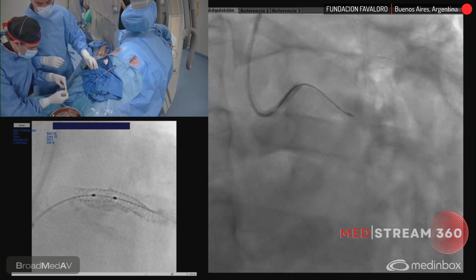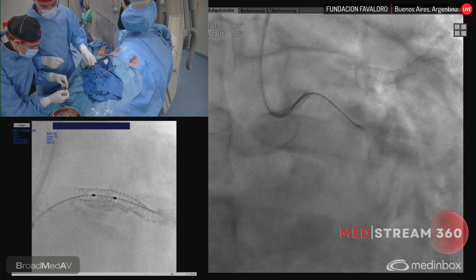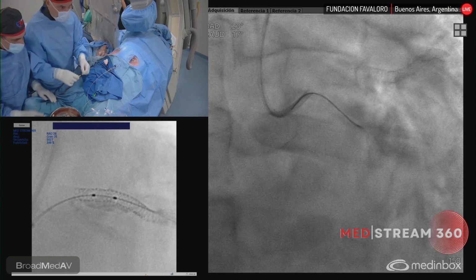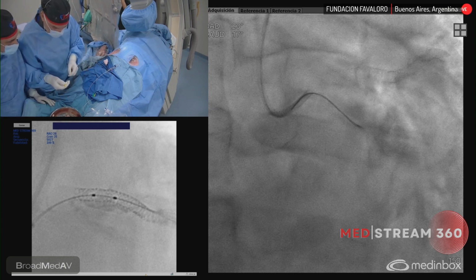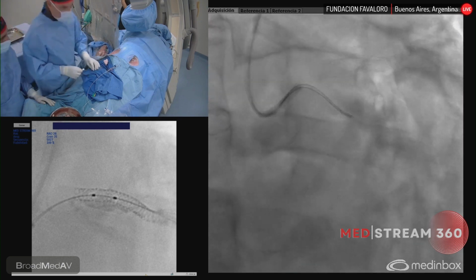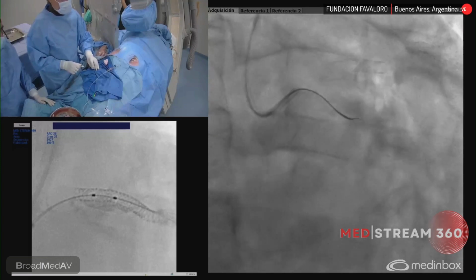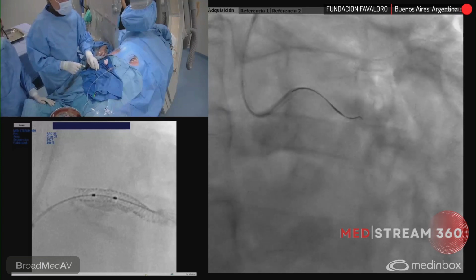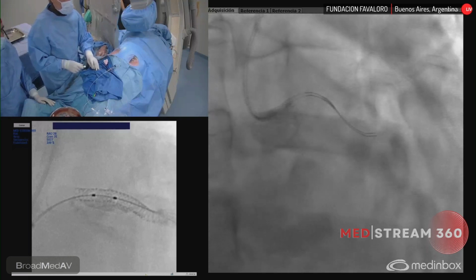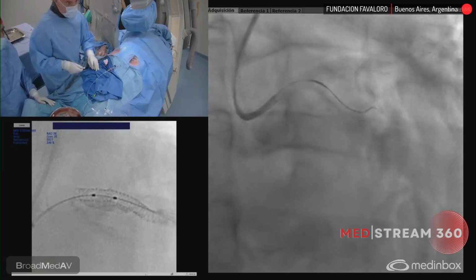When the transmission is finished, thank you to all of you for helping, for supporting, for watching, for commenting, and for everything. I think the case is going to take a few more minutes because we need to cross this tight stenosis. And you know, it's always a matter of time. Crossing. Yes. Thank you so much.